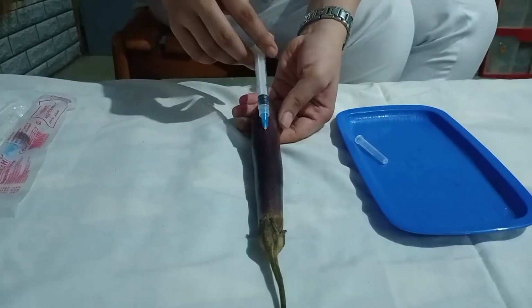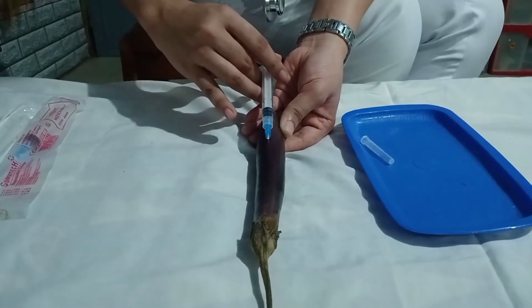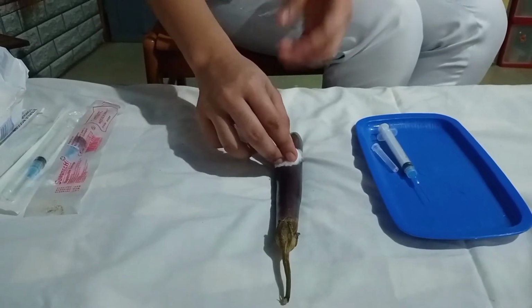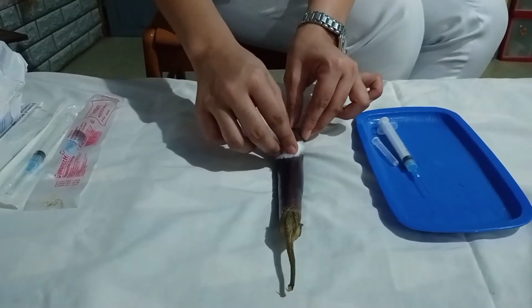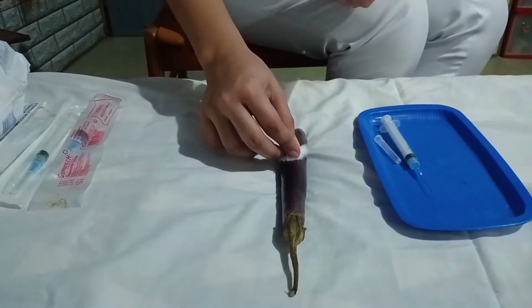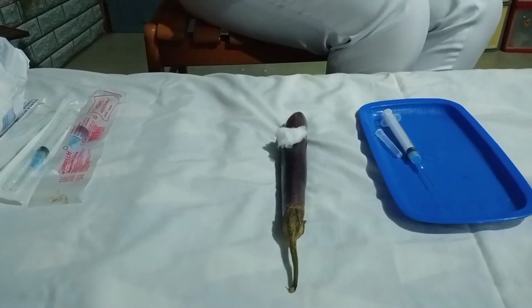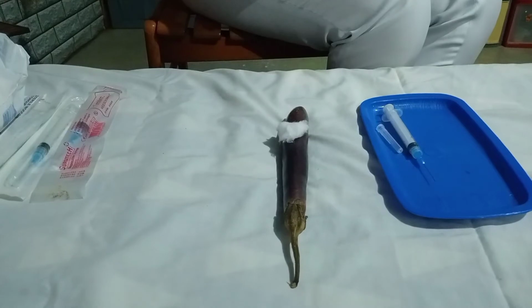I'm going to withdraw the needle at the same angle that it was inserted. The rationale for that is to minimize the tissue damage and discomfort of the patient. The next thing I'm going to do is encircle the wheal with a blue or black pen and instruct the patient or the watcher not to rub the wheal or erase the marks. The rationale for that is massaging the area may interfere with test results by spreading the medication to subcutaneous tissue.